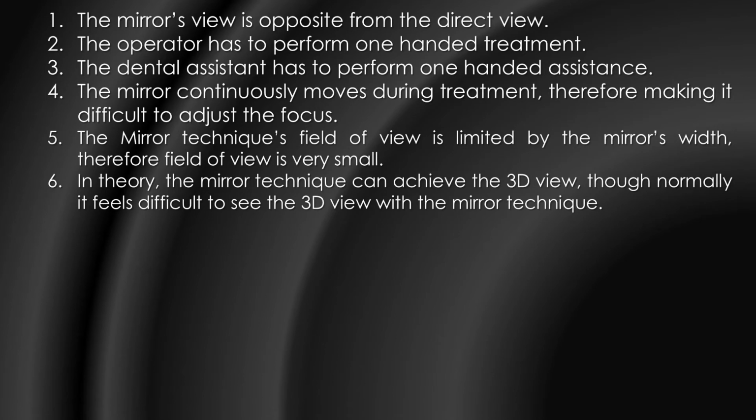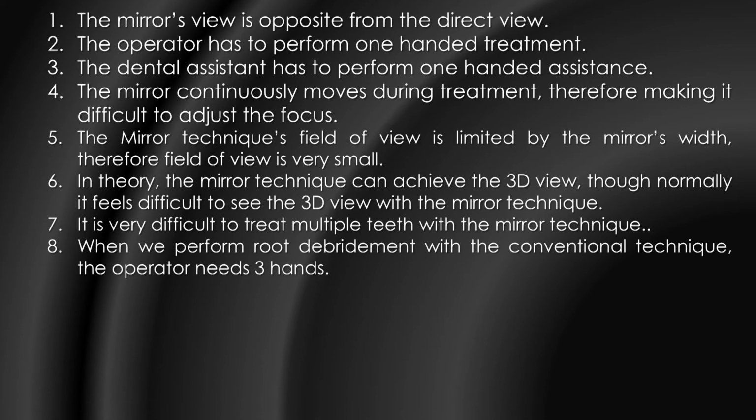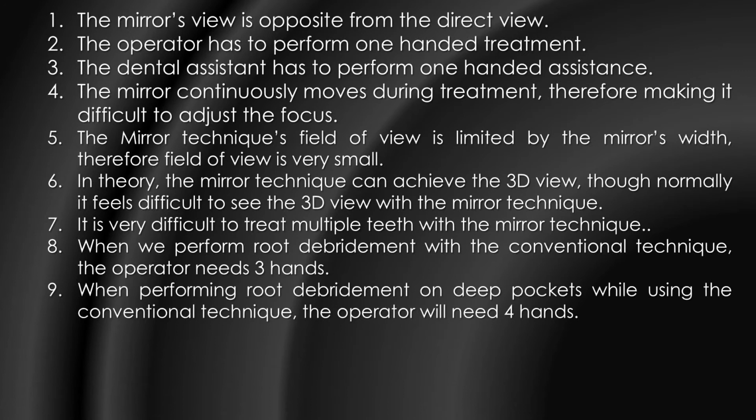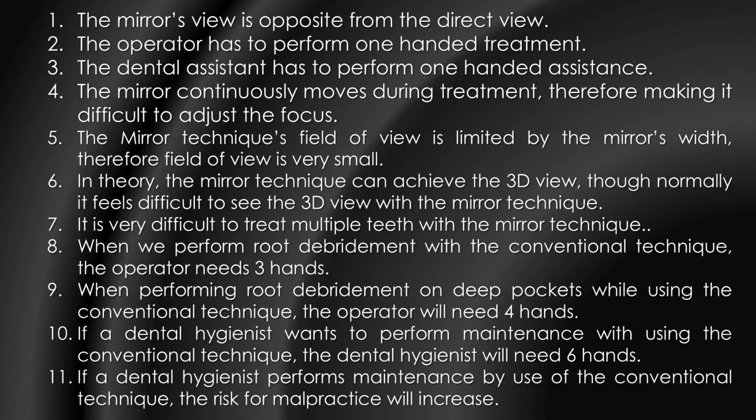Number 6. In theory, the mirror technique can achieve a 3D view, though normally it feels difficult to see the 3D view with the mirror technique. Number 7. It is very difficult to treat multiple teeth with the mirror technique. Number 8. When we perform root debridement with the conventional technique, the operator needs 3 hands.